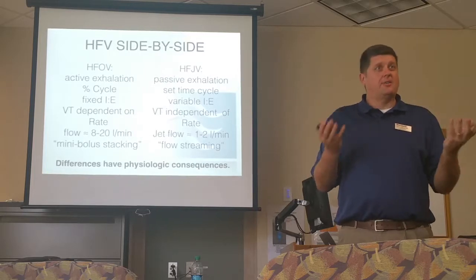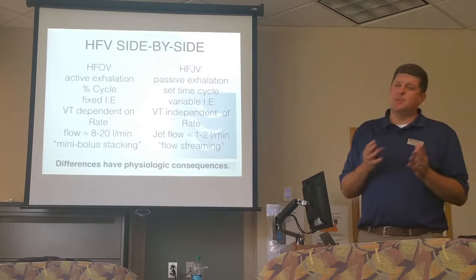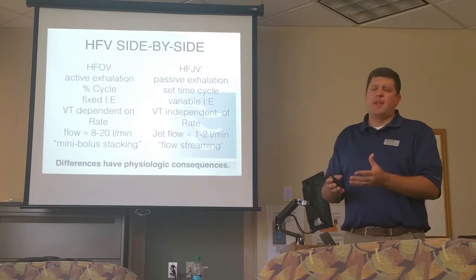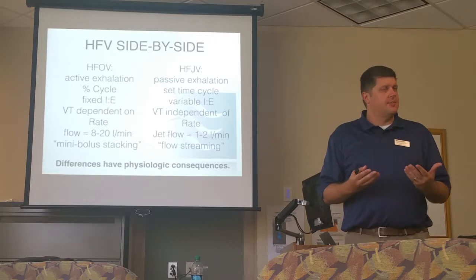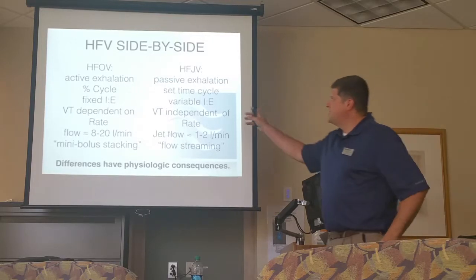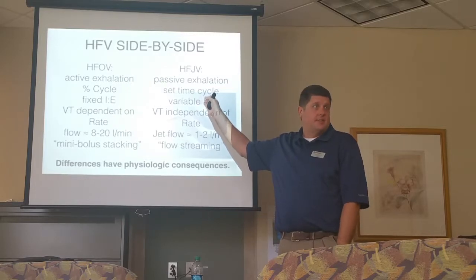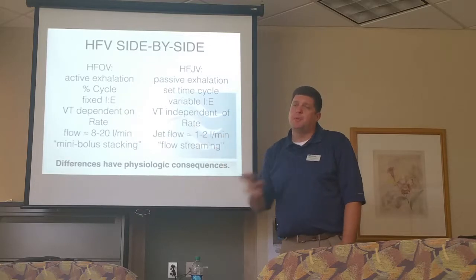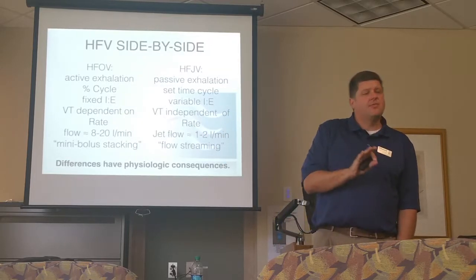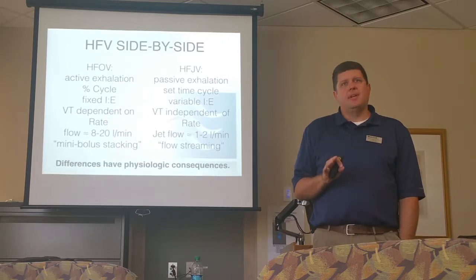Well, it's kind of hard to do, and that's where sometimes the jet can come in and help, especially with those patients where they are overinflated, they're gas trapping, certainly if they have established air leaks or something like that. The jet has just a set fixed I time, 20 milliseconds, that 0.02, that's it, that's the breath. And because the I time is set and fixed, when we adjust the jet rate, we can get different I:E ratios. And that's real important because our babies in here are gas trapped, plain and simple.